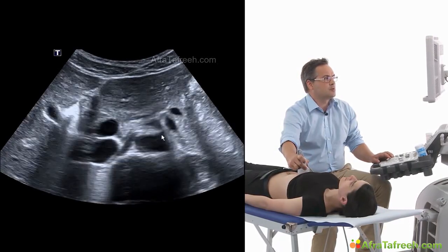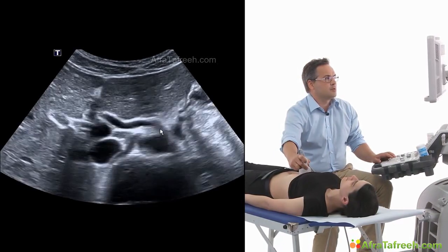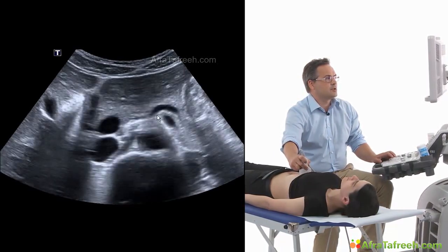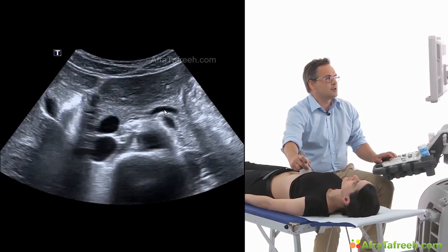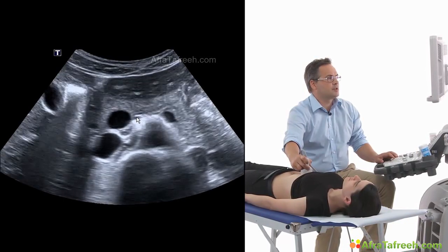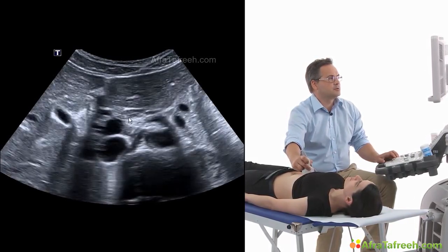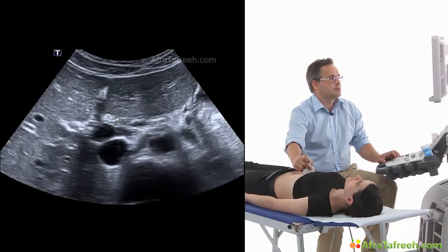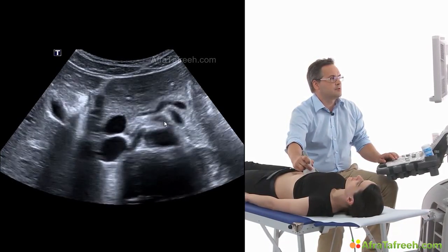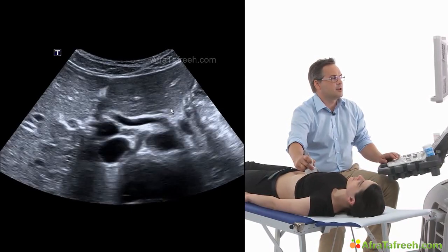The first branch we can detect is the celiac trunk with 2 branches, the splenic artery to the left patient side and the common hepatic artery to the right patient side over here. Celiac trunk, common hepatic artery and splenic artery.